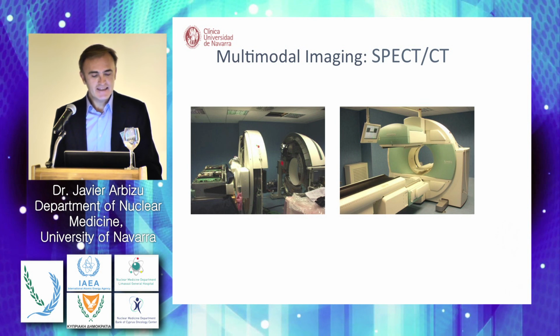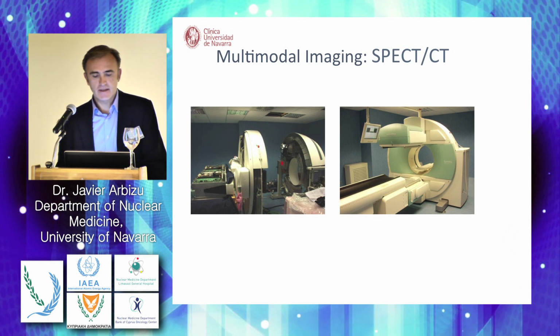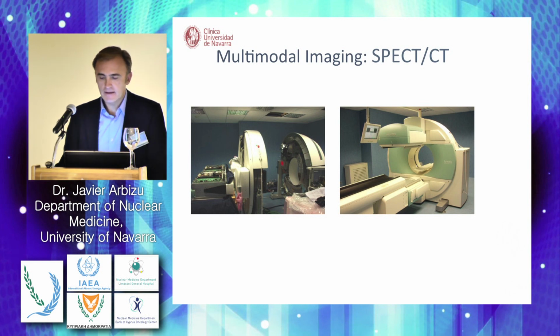So this is the SPECT, and this is the CT, and this is the final device once they are combined. So this is multimodal, but very close one after the other. These are the two detectors that are just taking pictures of the patient in this way.